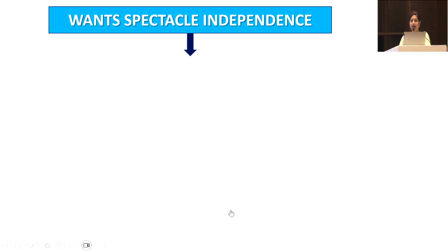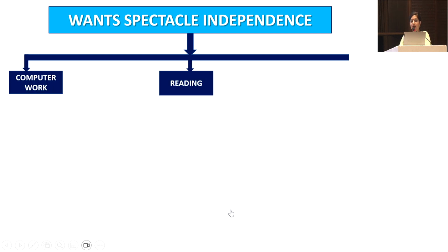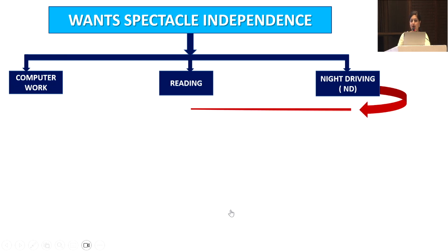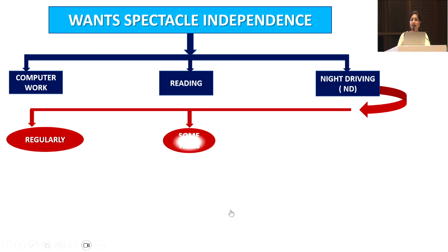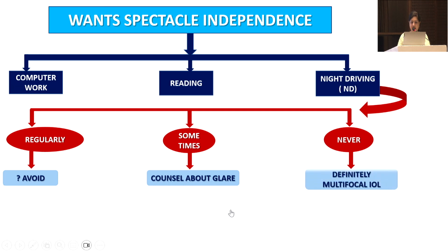So a patient comes to you needing spectacle independence. There are 3 questions that we ask our patients: how much computer work is he doing, how much reading per day, and if he's doing any night driving. So if he is doing regular night driving, then it's a very important call that you need to probably avoid a diffractive trifocal, for example, and go ahead and use either an extended monofocal or an EDOF where the chances of glare and halos are less.